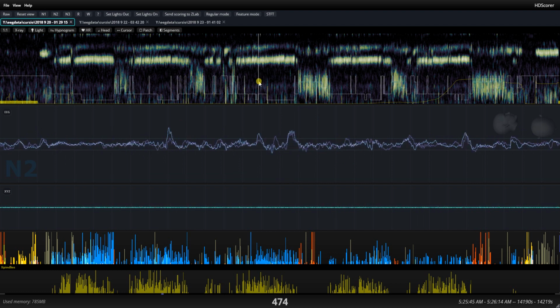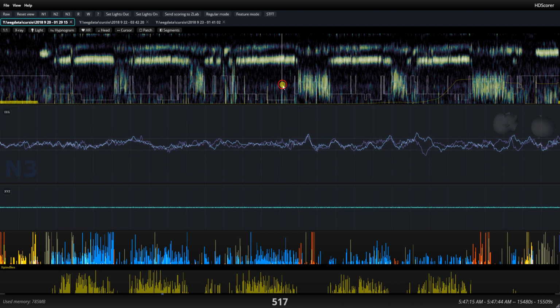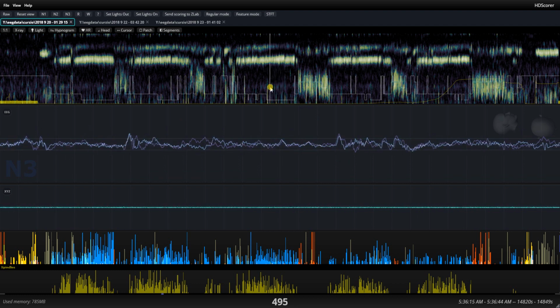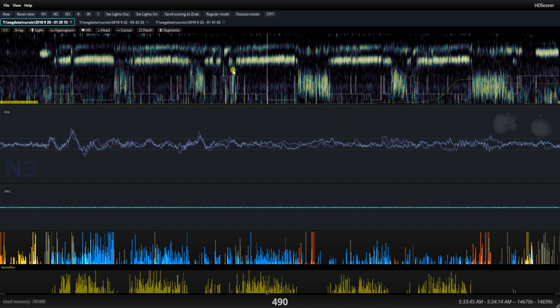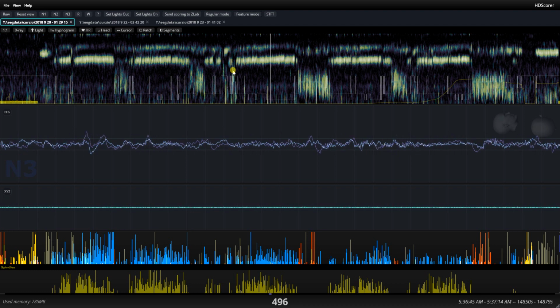Yeah, this looks quite a bit different from right here, maybe, well, here for sure. A lot of scorers go epoch by epoch. In fact, I think you're supposed to do that. For each epoch, they see, am I above the threshold? Is it 20% of the epoch? It's very difficult to apply that kind of guideline in a scientifically accurate way, because it's just too subjective.